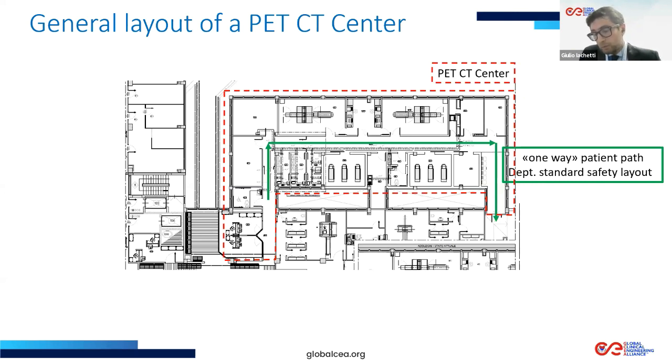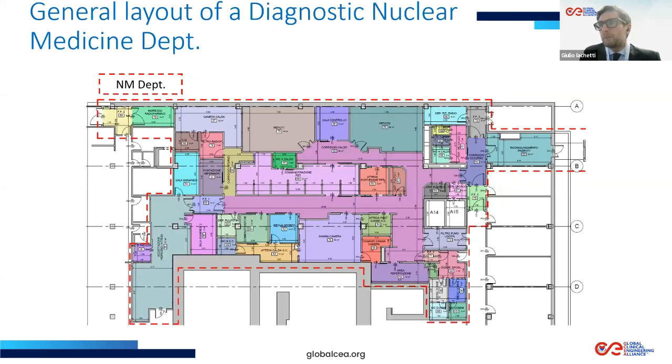In general, the patient should not cross the path of another patient, because the exposure of another patient to the first one is an exposure that shouldn't be justified. With the same principle, the operators maximize their safety.